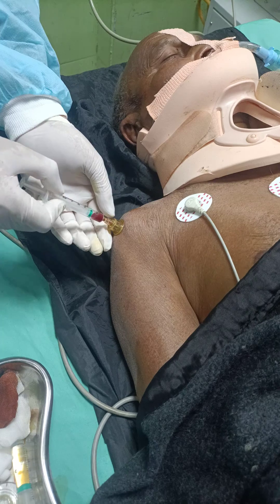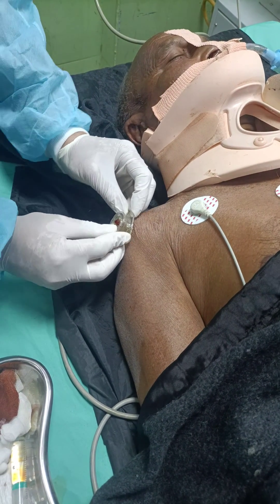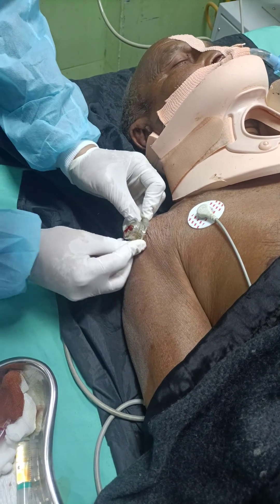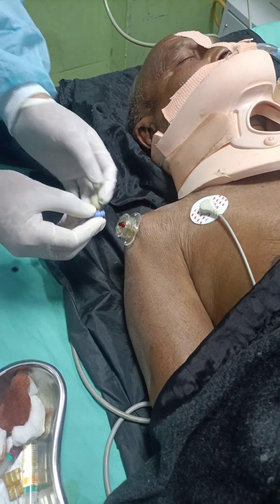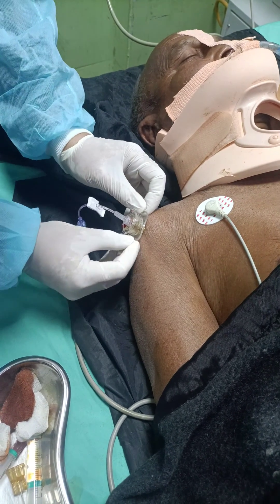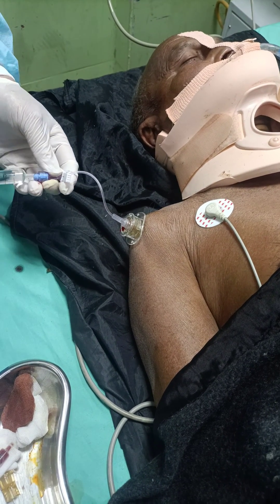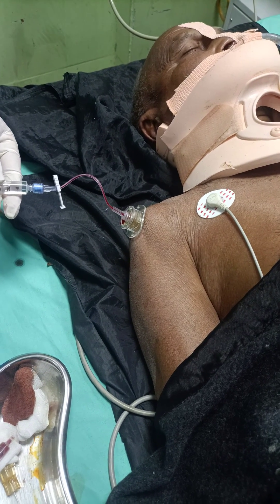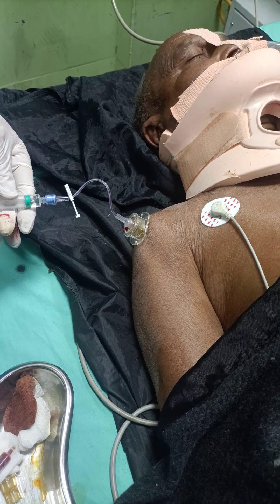We are in the bone marrow now — we'll fix the connector. Push 5 mL saline to open the bone marrow. You must not encounter any resistance.